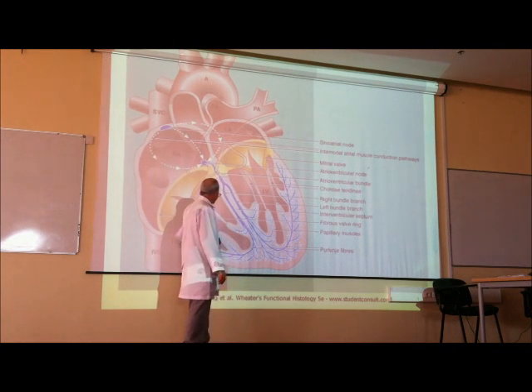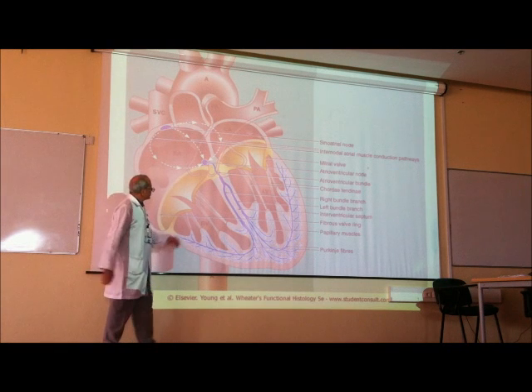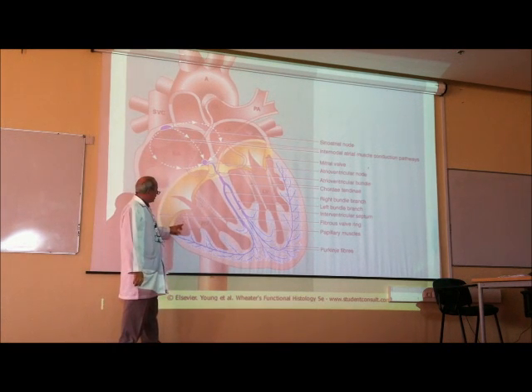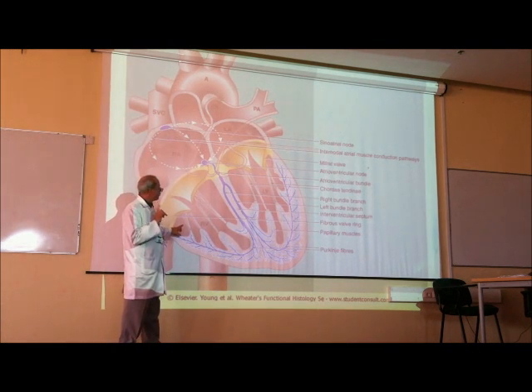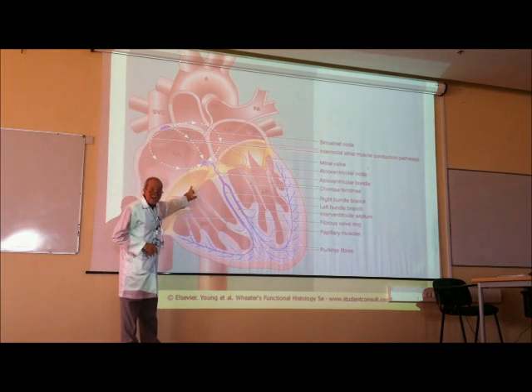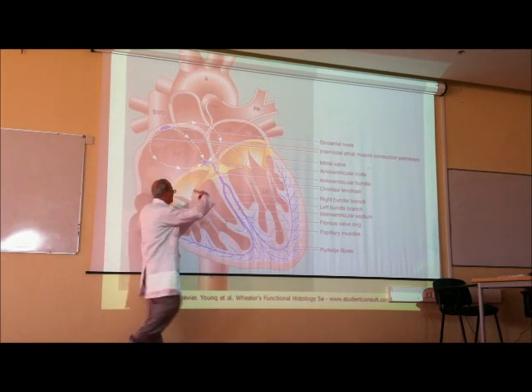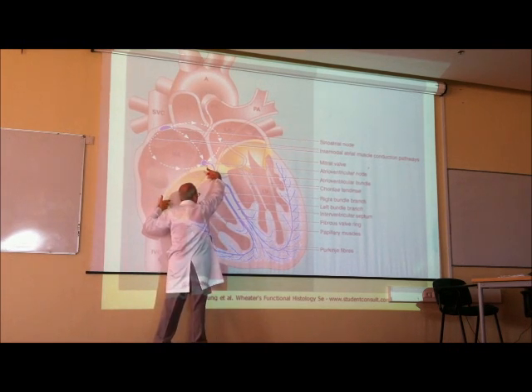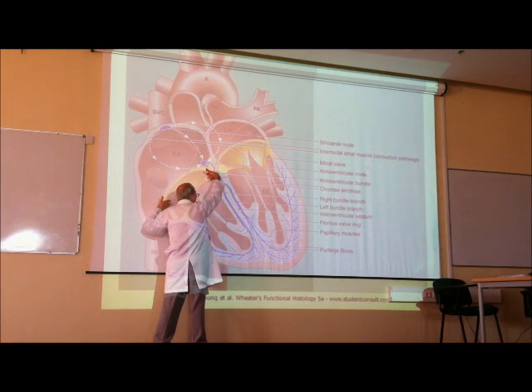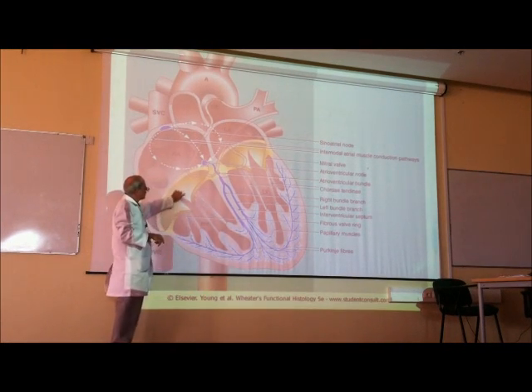And these are the chordae tendineae, which extend from the papillary muscles to valve leaflets, because the valve needs connective tissue to give support and not allow the valve to dilate. And these are the valve leaflets.